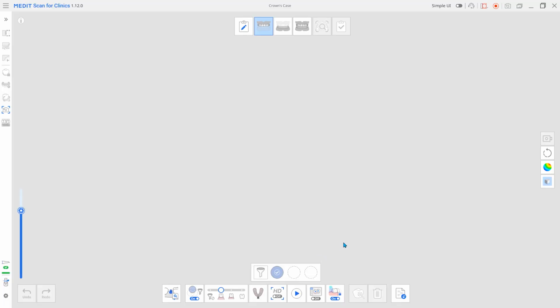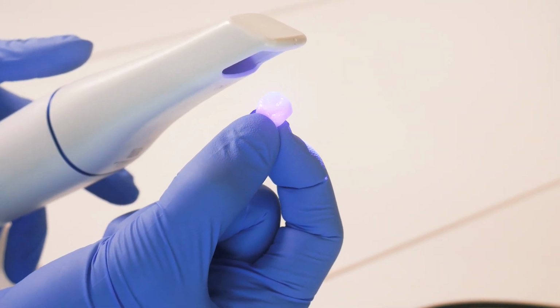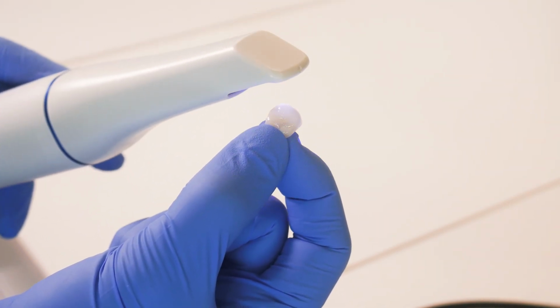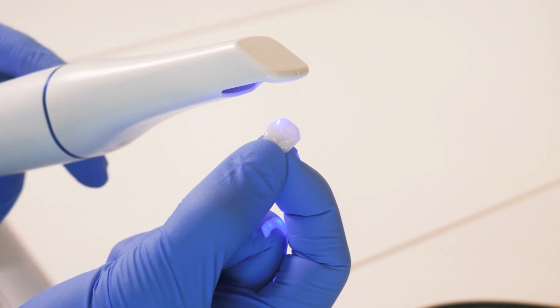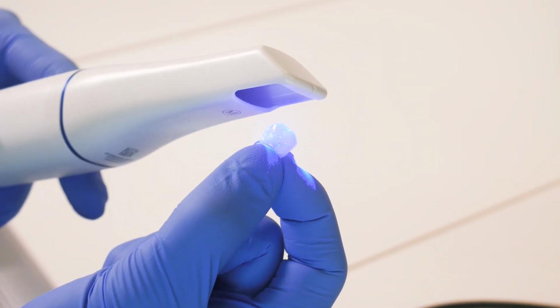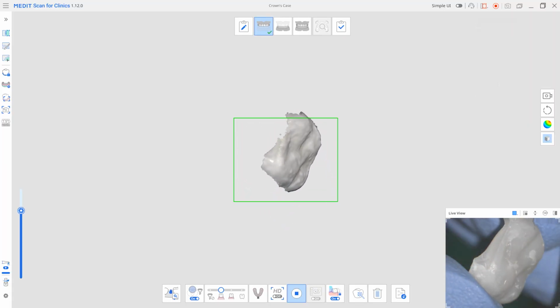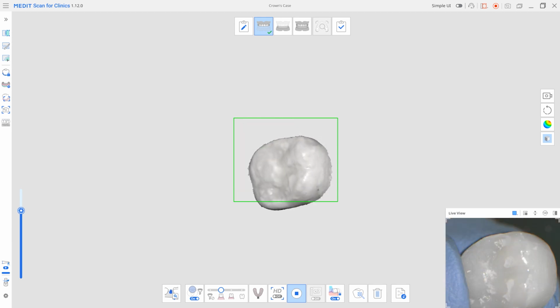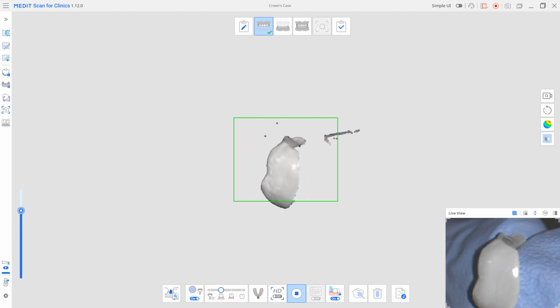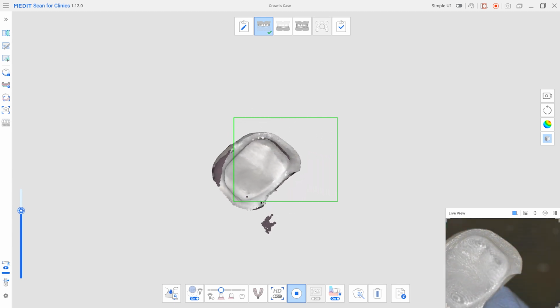Color registration is complete. Now, scan the milled prosthesis. As you can see, the color of the glove holding the crown is automatically filtered out from the collected scan data. This is very convenient because there is no need to edit out unnecessary data.